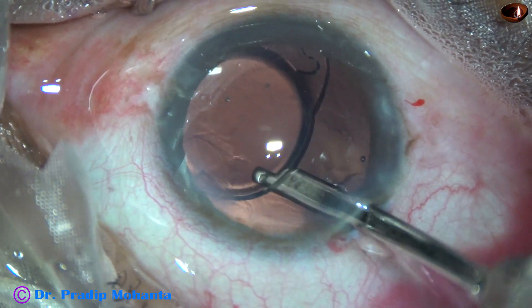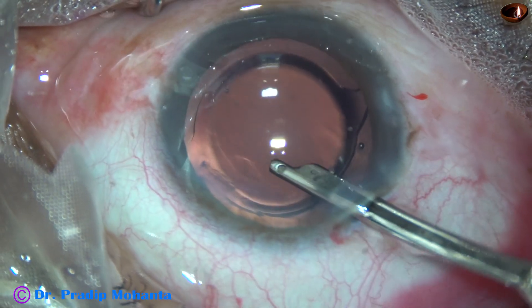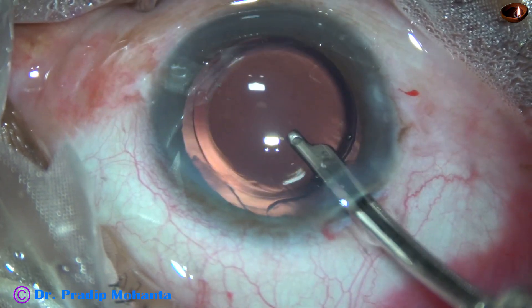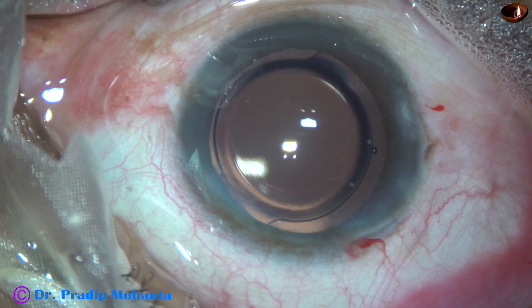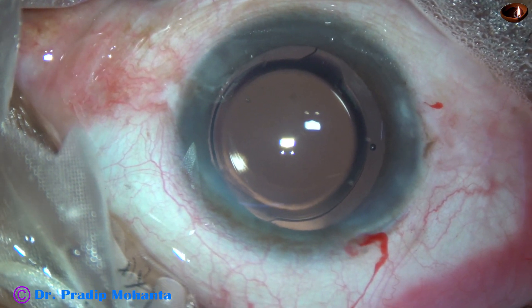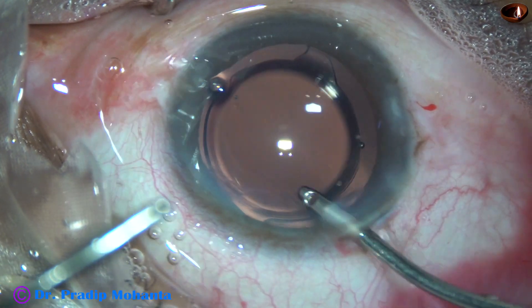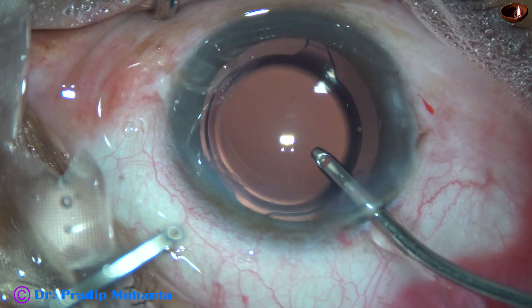Now is the time to remove the visco, and we must do it thoroughly. I usually use a Simcoe cannula first — remove most of the visco by the Simcoe cannula — and then I use the irrigation-aspiration cannula of bimanual IA. Here goes the irrigation-aspiration cannula. First, I use the irrigating cannula only.